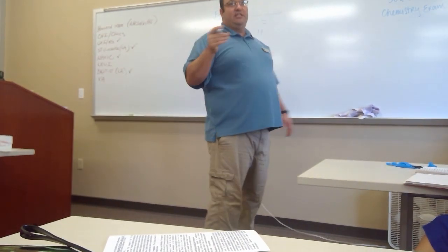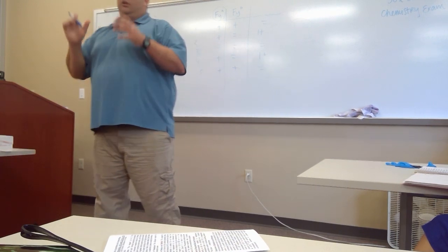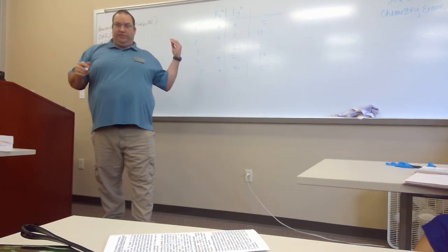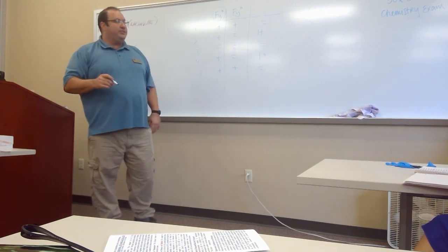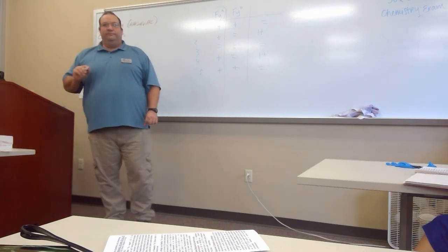But I built 5 or 6 of them to just practice this. Practice ruling them out to figure out what's left, what's our culprit. And on at least 1, maybe 2 of those, I did it with dosage, where you get the different strengths of reactions, because anytime these are inherited together, it's going to be weaker.